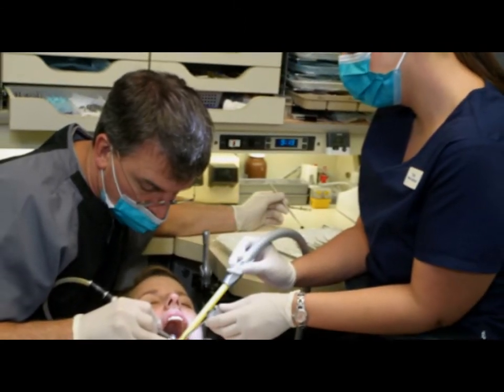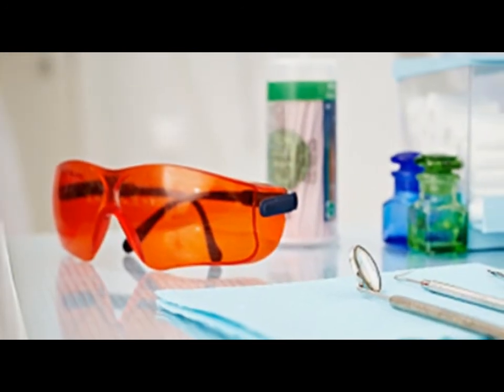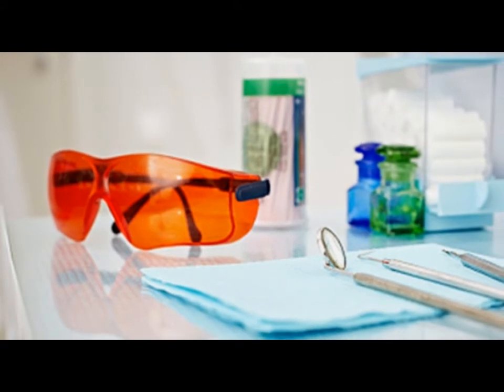Composite is hardened by applying a high-intensity blue light. It only takes a few seconds for the material to harden.